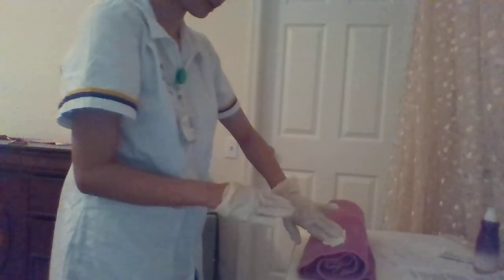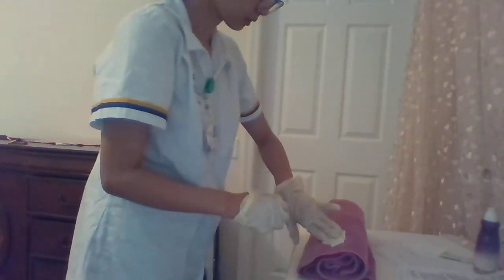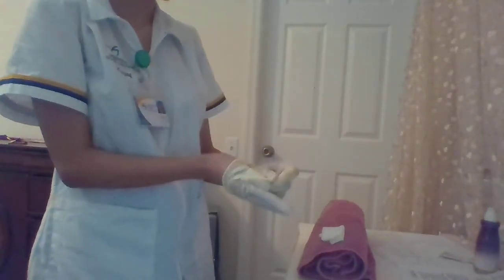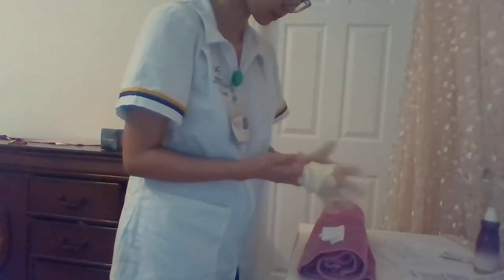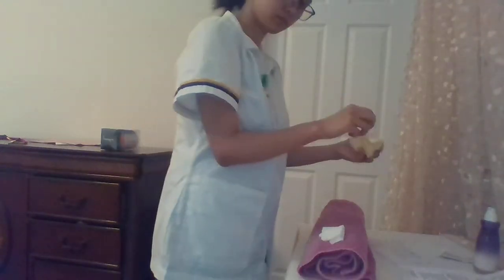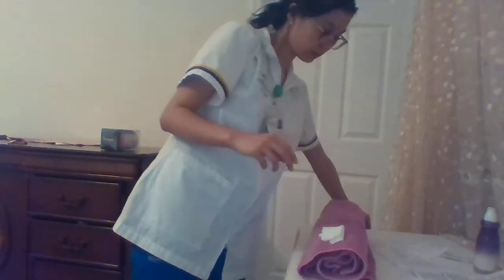And I am going to clean up all the waste, and then I'm going to remove my gloves. And after that, I am going to document the administration of the medication.